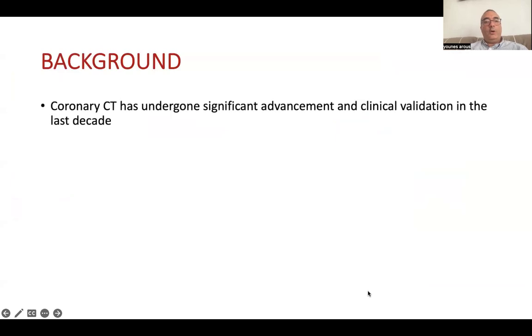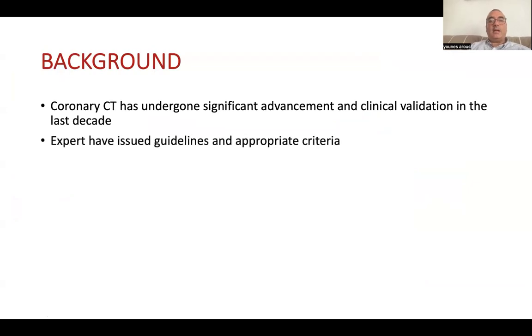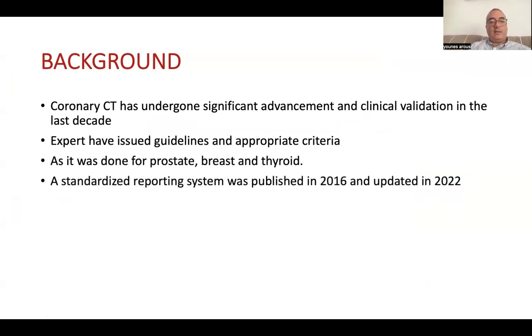So we all know that coronary CT has undergone a significant advancement and clinical validation in the last decade. Experts have issued guidelines and appropriate criteria, as was done for prostate, breast, and thyroid. A standardized reporting system was published in 2016 and updated in 2022.